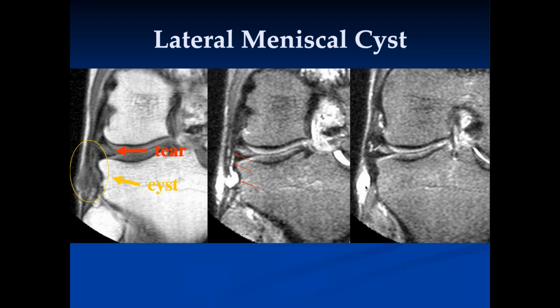It almost looks like something has teeth, and you go inside the tear, and you just keep nibbling away at the tissue until you get all of it out, and then you might throw a suture or two in there to get the meniscus back together again. Good. That's the usual technique for these.